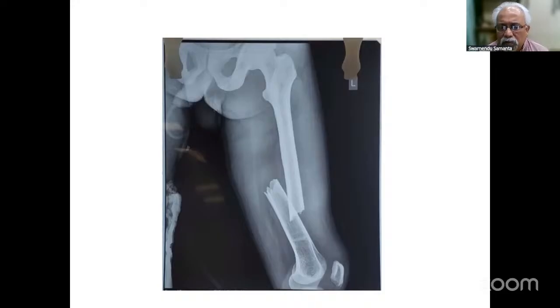Yes, so that was the hint to you, Dr. Rajan, that whenever you see a single film of any fracture, you can comment on that part of the X-ray, but the examiner will ask you whether you want to do something else. Because a transverse fracture in a shaft femur is a high velocity injury.